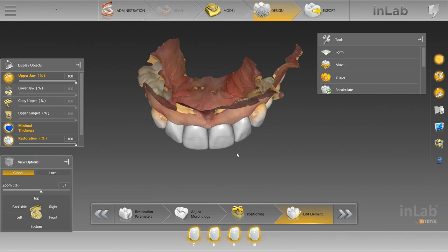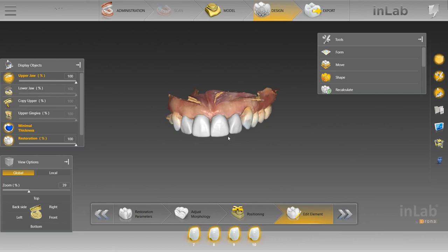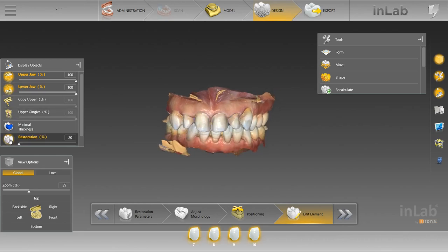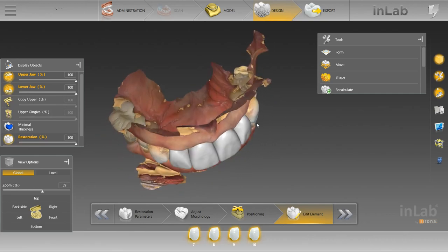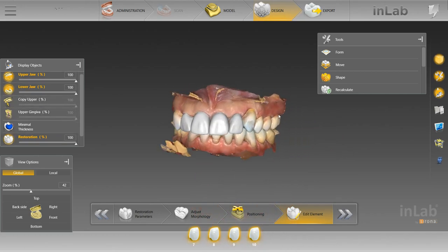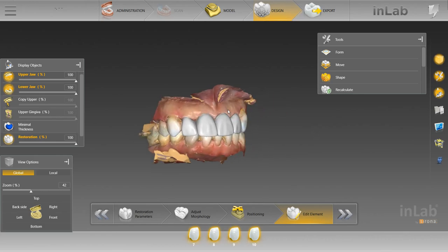When a case is already set up ideally — the teeth are properly spread out, all in line, enough reduction, nice shoulder — it's all set for you to make an ideal design. To me, that's not as impressive as something like this where you're really just trying to make something out of nothing. I think this is a great example of making something out of not necessarily nothing, because the preps were adequate given what the dentist had to work with, but it was difficult nonetheless. You will encounter these non-ideal cases more frequently than ideal ones, so there's actually a lot more to learn from them.